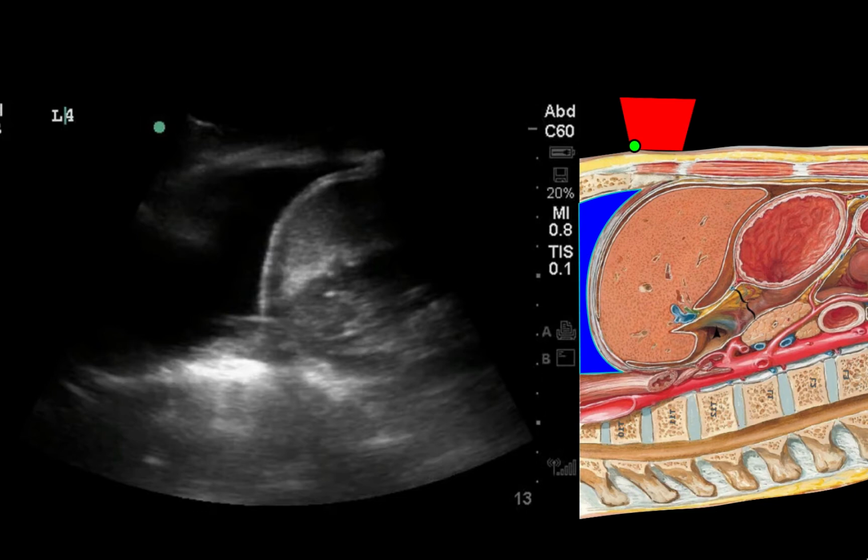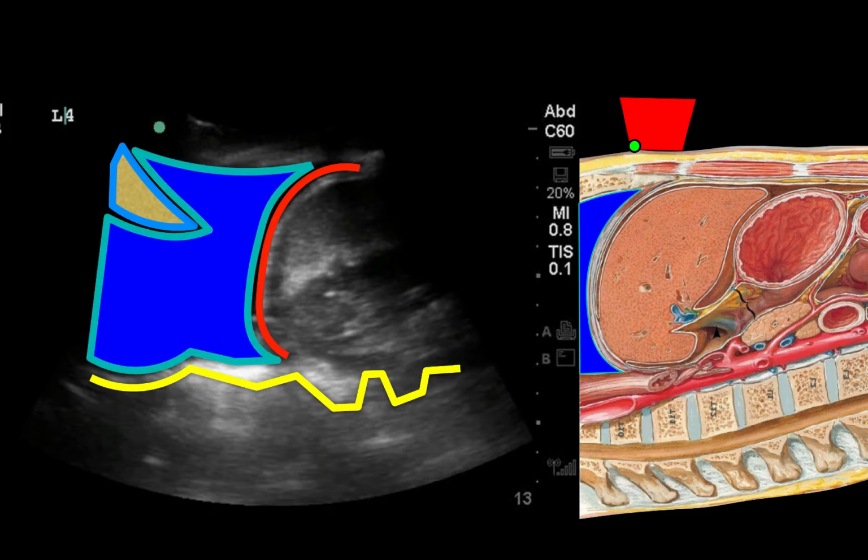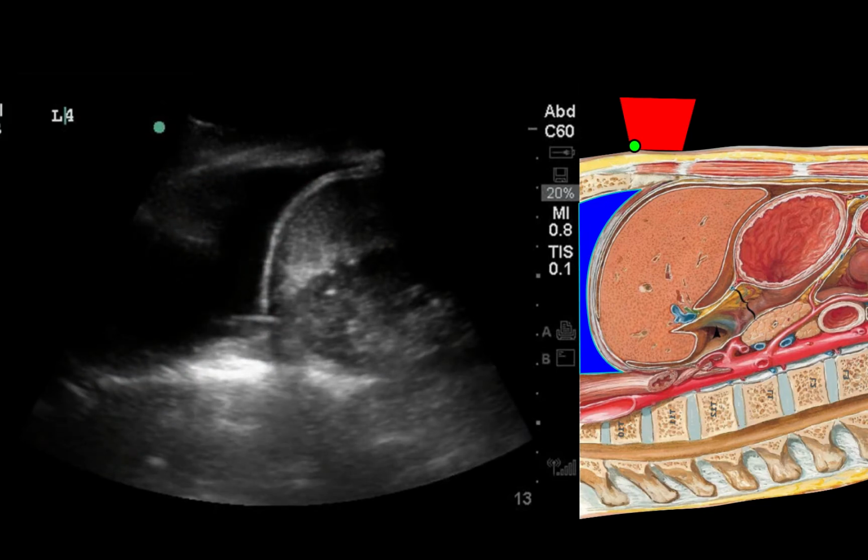Here's the diaphragm, a little sliver of collapsed lung, and the spine now visible well into the thoracic area because of all of this pleural fluid here. This is known as the spine sign, and it's the most important thing you're looking for in this exam. Here's the patient making very scary, poor efforts at breathing due to all of this disease.